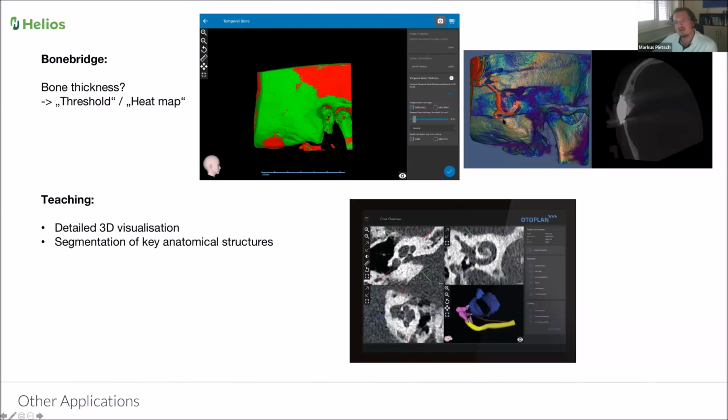And you see here the post-op image. Post-operatively, we placed the FMT just in the position we wanted it to have. And you see here the dura and the sinus were very well preserved.